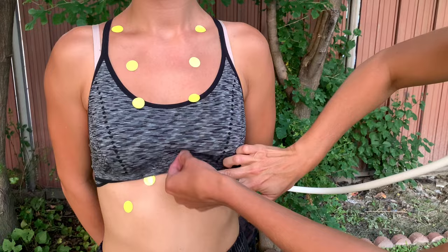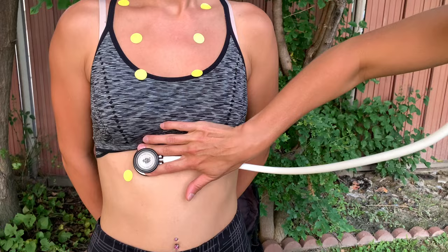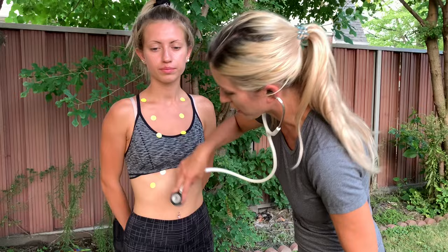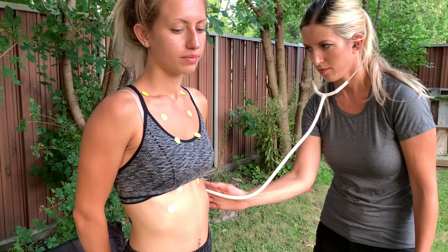Deep breath in and out. You want to listen for a full breath in and out at each landmark. Then you can also listen at the mid-axillary line on each side. That covers the anterior landmarks to listen to the lungs.